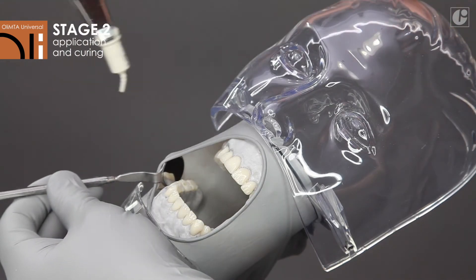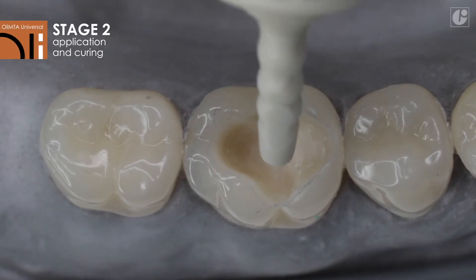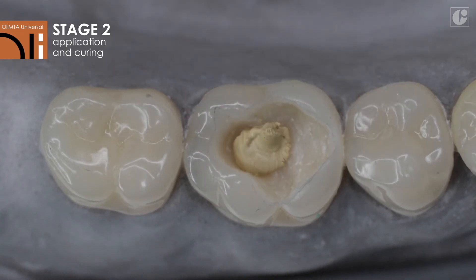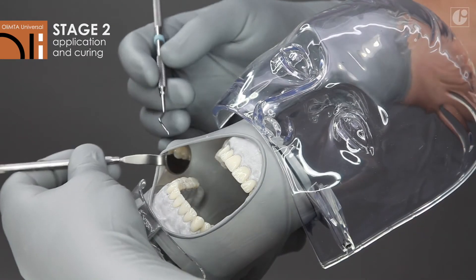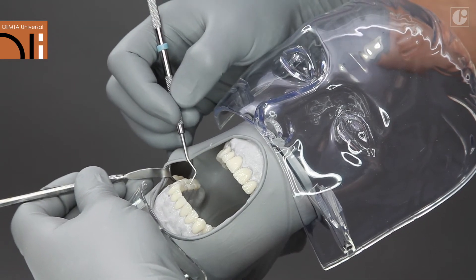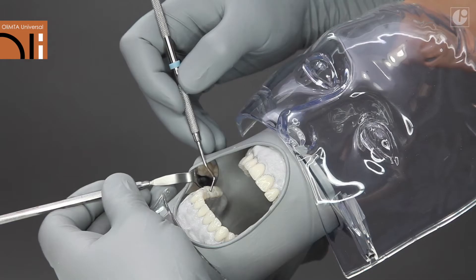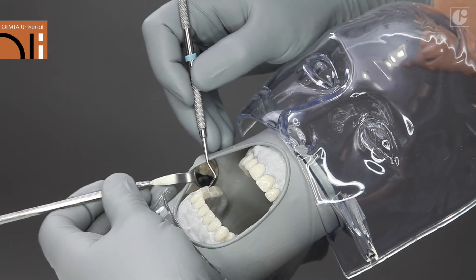Apply the appropriate amount of OliMTA Universal to the previously prepared cavity directly from the capsule or after squeezing out the contents onto a slide. Spread out evenly to cover the exposed pulp. The homogeneous consistency of the material ensures comfortable condensation in the treatment area.